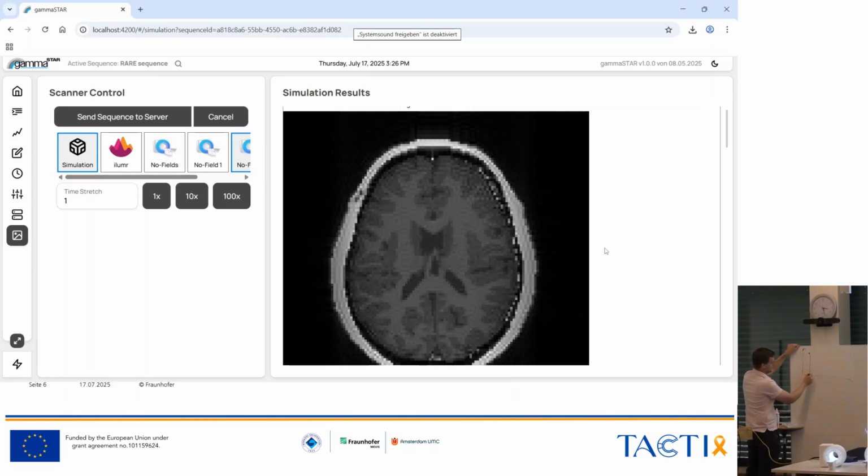It then recovers. But at some point, we want to excite it again. So we could wait for it to be back at the equilibrium state, but then we would need to wait for seconds. But we want to be fast, so we just say we measure again after 500 milliseconds, exciting this again. And then it's again recovering.